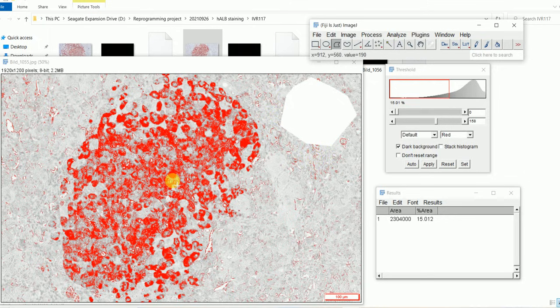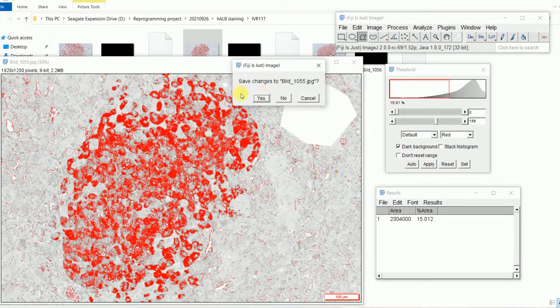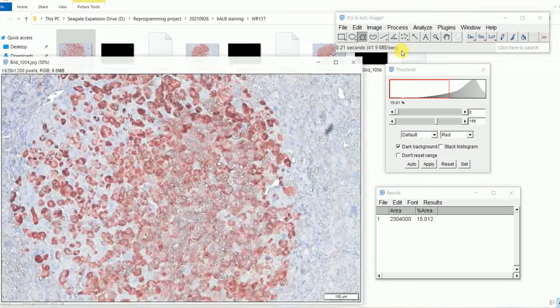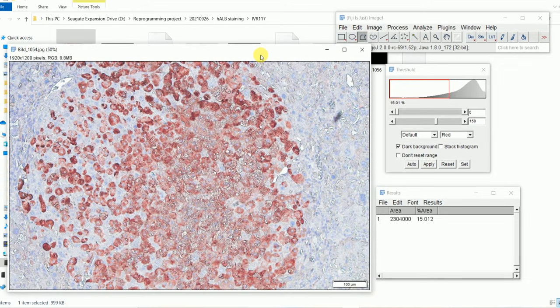Maybe I can show you another example, and with that example I can make it clear how to reduce the background. I'm just going to get rid of this image. I will now quantify another image just to make clear what I want to explain: that we can get rid of the background that is not a part of our positively stained area. For that, I will explain one more time what we can do.